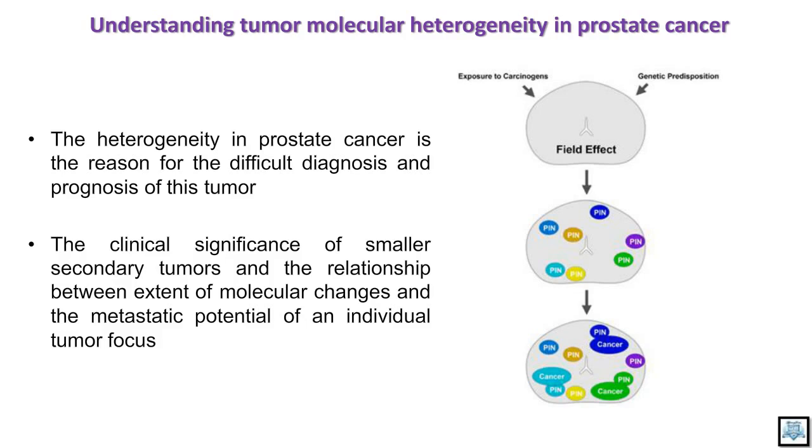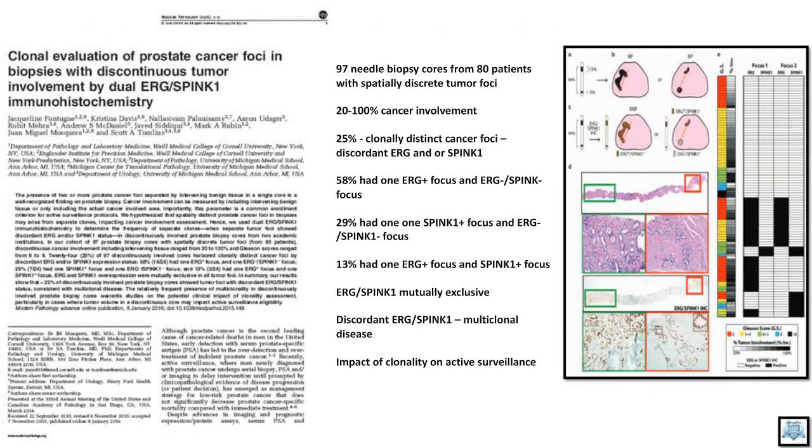As I showed before, you may have different clonal populations of cells driven by different driver molecular aberrations in these cases. So we have done a pilot study a few years ago where we showed that we can demonstrate this type of tumor heterogeneity even in needle biopsy samples as well.